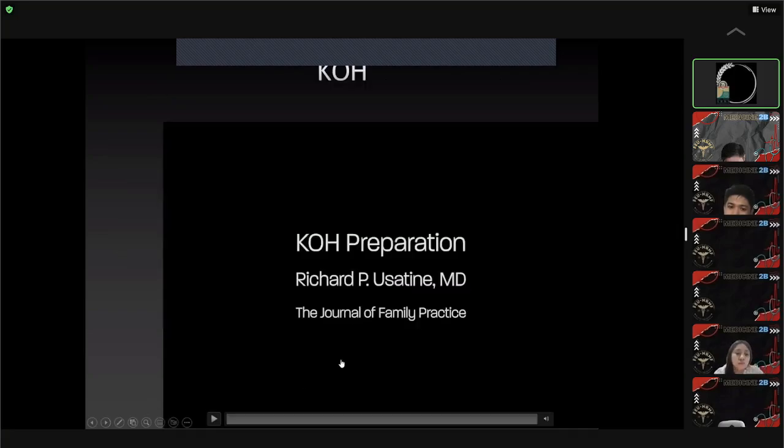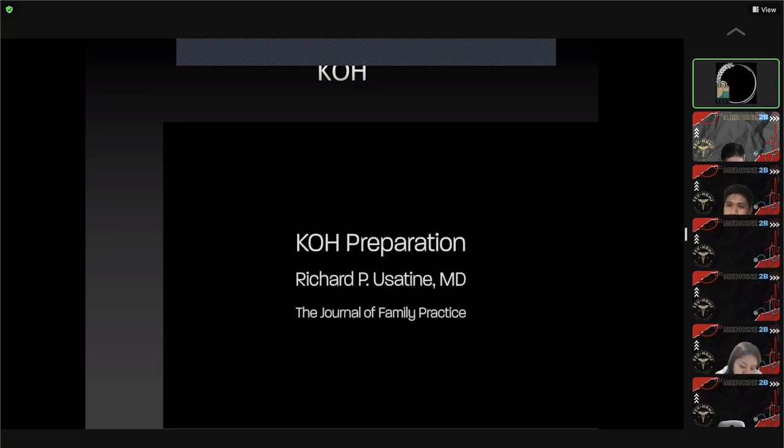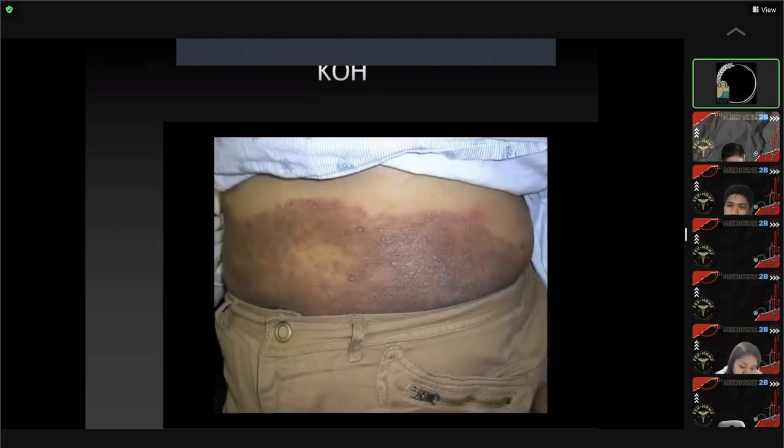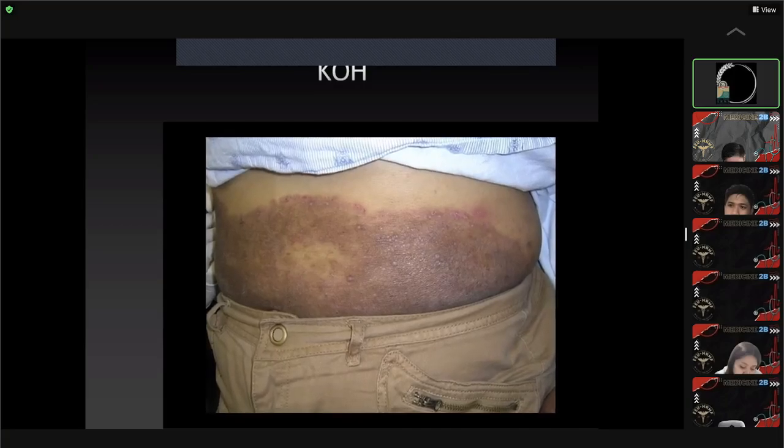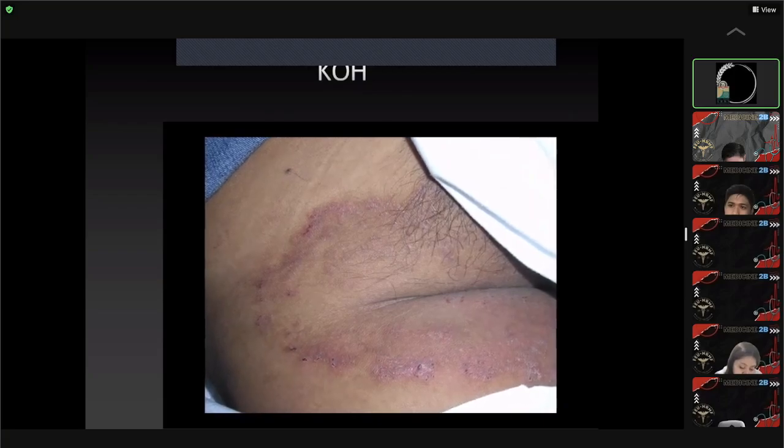Okay, this is the KOH preparation video. Demonstrate the KOH preparation for diagnosing fungal skin infections. The quickest and most accurate method for diagnosing fungal skin infections is the KOH preparation.